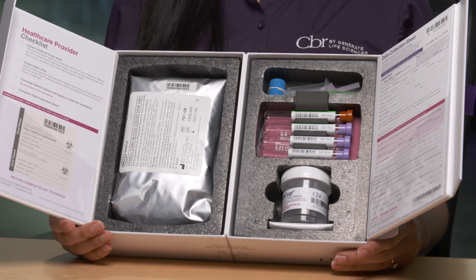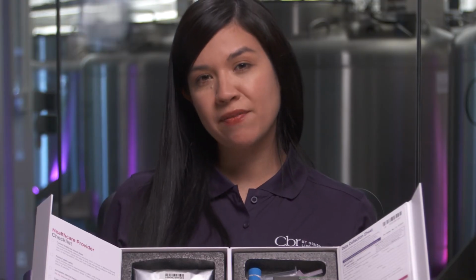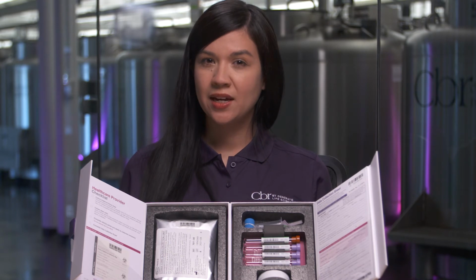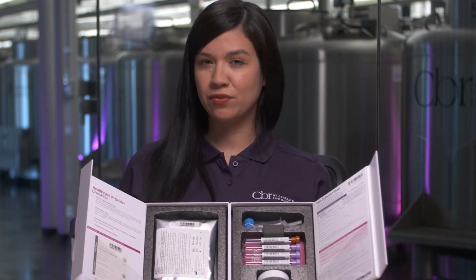Condensation could occur inside of the tubes, and that's normal. It's very important that the hospital staff understands to include these in the kit with your baby's cord blood and cord tissue. If we do not receive the maternal blood draw tubes along with your kit, it can impact how you may be able to use your baby's newborn stem cells in the future.